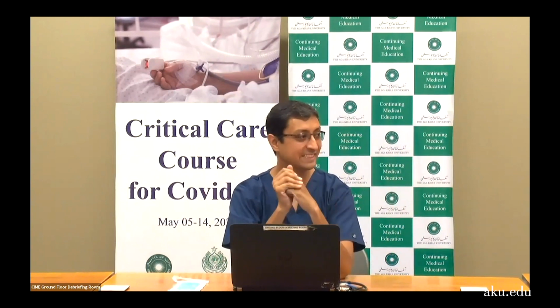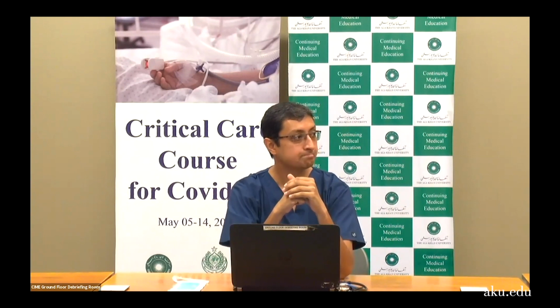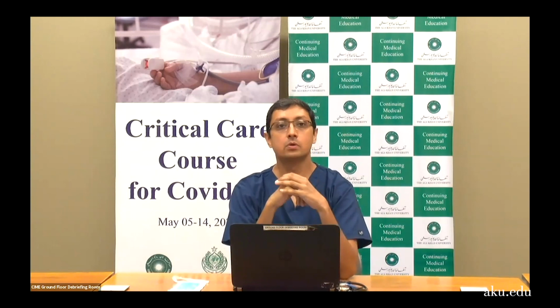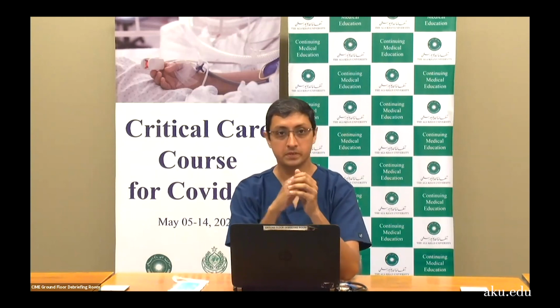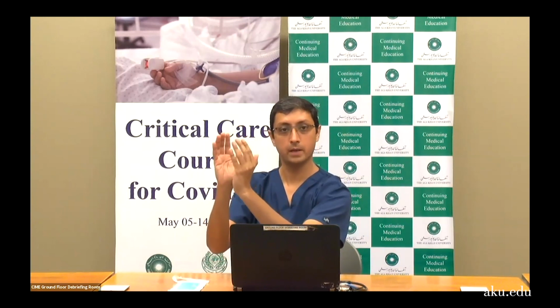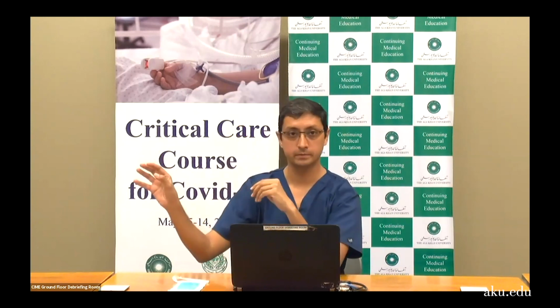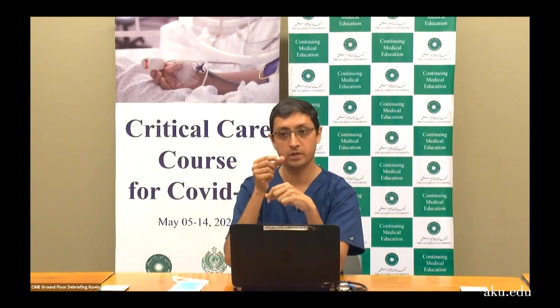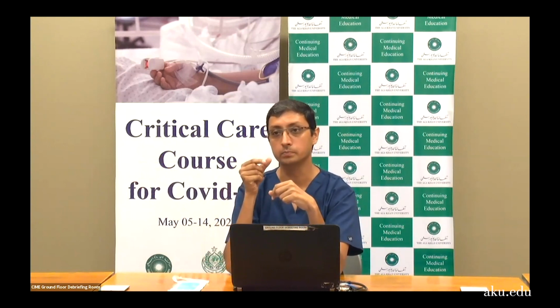The last question, sir. I couldn't understand the difference between volume and pressure ventilators that you have mentioned in your presentation. Can you please explain it again? Right. So in volume, we set the volume. I want to deliver 400 ml volume to the patient, and it will be delivered. In pressure, we set the pressure limit, the airway pressure, which is measured at the end of the ET tube.